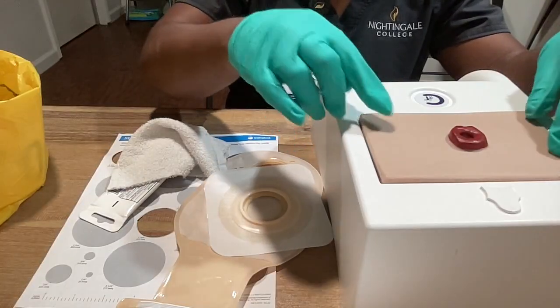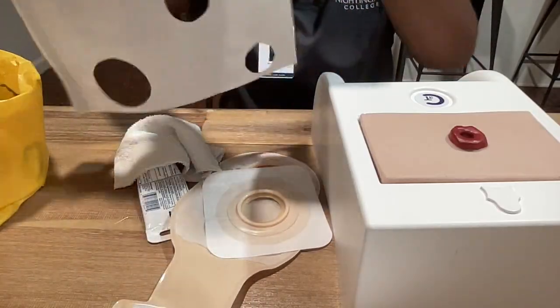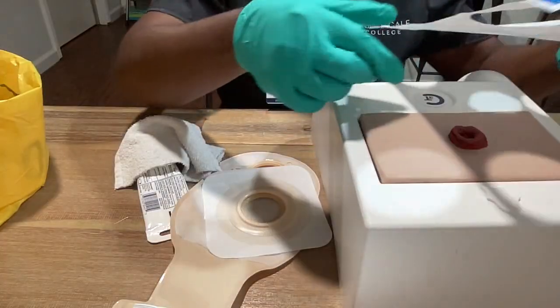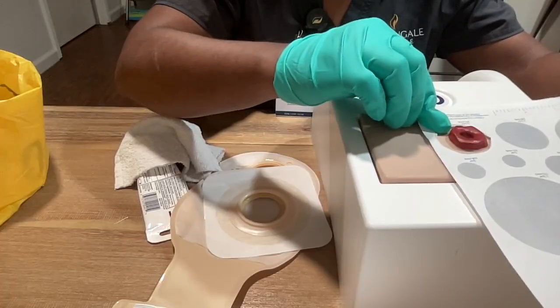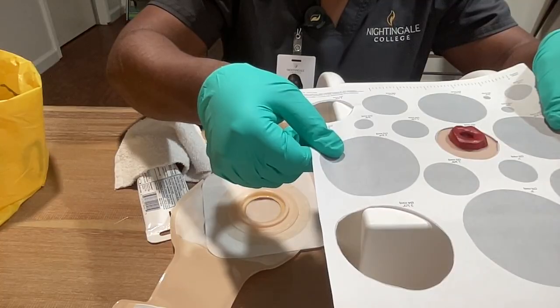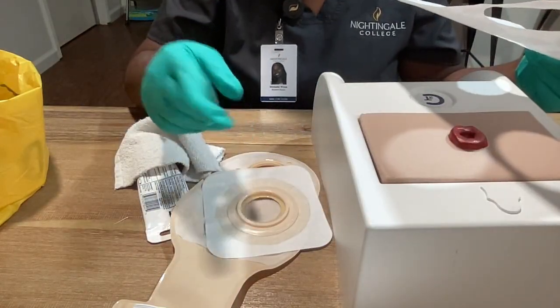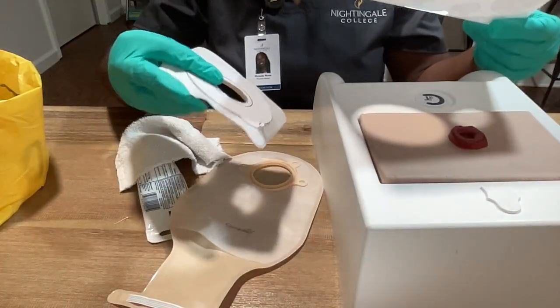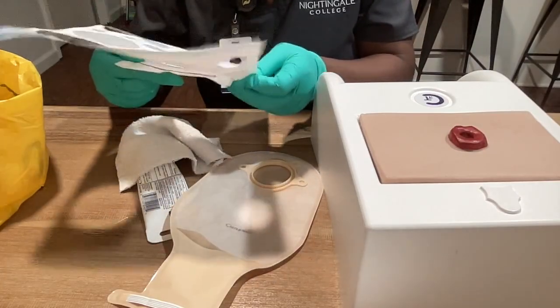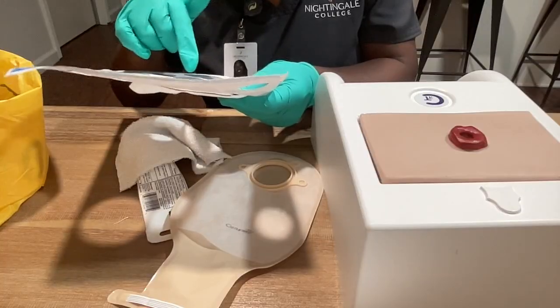Next, I want to measure this to determine the size that I should cut on a base plate. So I am going to get my measuring tool. That looks too big. That's kind of too small — it'll be too snug. That looks perfect: the 45 millimeters. You don't want it too tight or too big. Now I will put it against my face plate, draw a circle to make sure it's the correct size, and then I will cut it out.